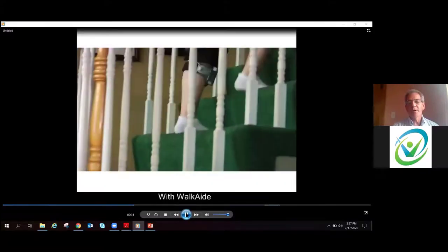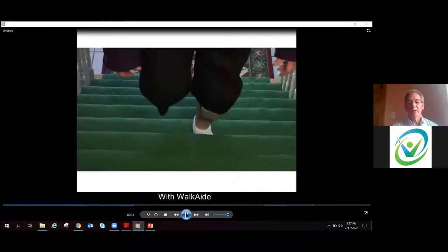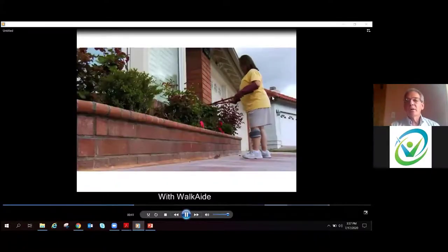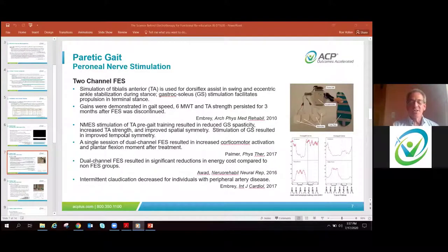Using an accelerometer there to help detect changes in position to activate dorsiflexion on time. So, you know, not every patient is going to have the same response. So obviously there can be quite a bit of variation with upper motor neuron injuries.